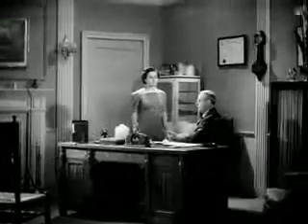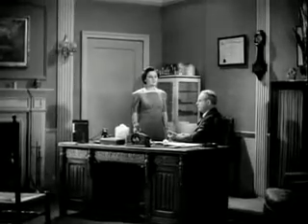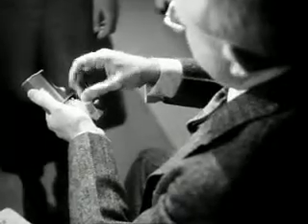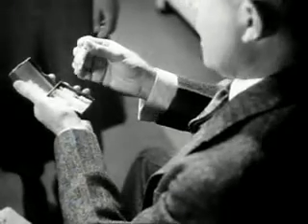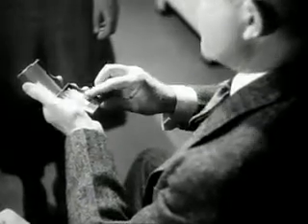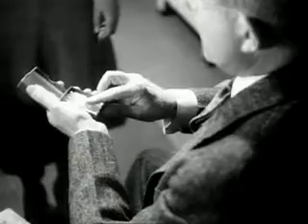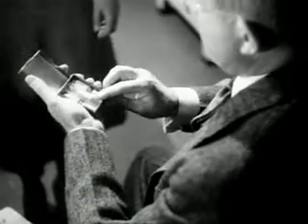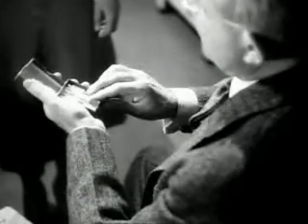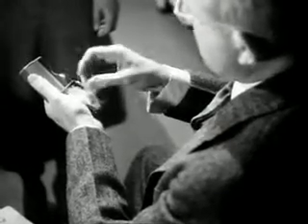We use purified protein derivative instead of old tuberculin because it's more uniform and is standard. It's put up in 2 strengths, accompanied by vials of sterile buffered saline solution. When a tablet of the first strength is dissolved in 1 cubic centimeter of the saline solution, 1/10 of a cubic centimeter contains the recommended dose. If no reaction follows the use of the first strength, the test is repeated with the second strength.